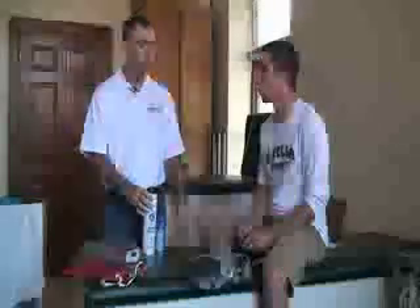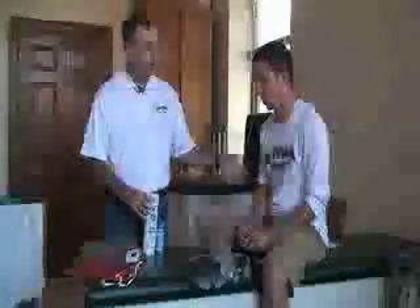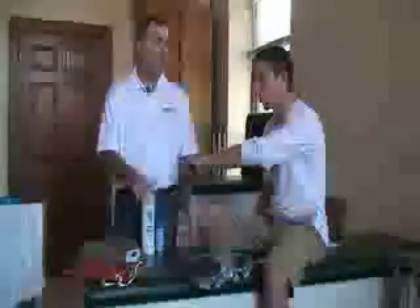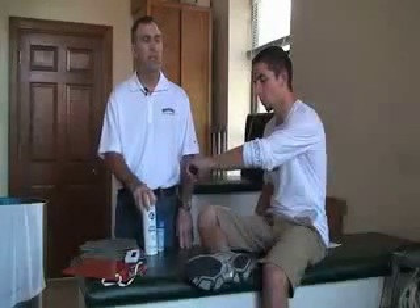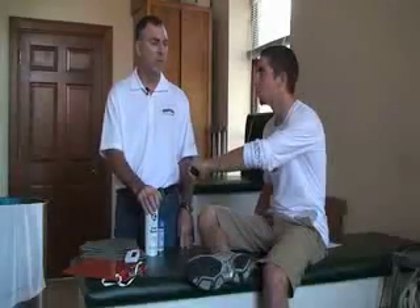First thing that you want to do is inspect the area — we're going to be doing the forearm. Make sure you determine how big the area is that he's injured. Find out if he has the indications to use this modality and also find out if he has any contraindications, especially any allergic reactions to cold.